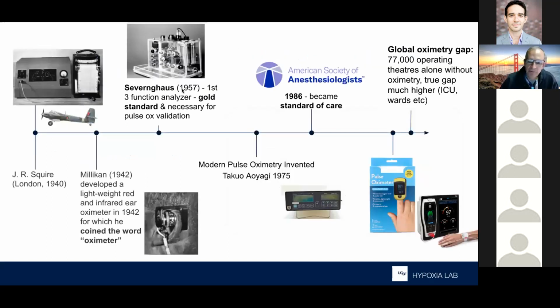The history of measuring oxygen in the human body is quite interesting. As technology often is, it's driven by other changes in society. And World War II was sort of a seminal event. The British were trying to design warplanes that could ascend to very high altitudes. And so it became important to measure the oxygen level in pilots.